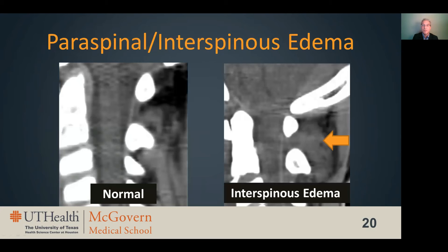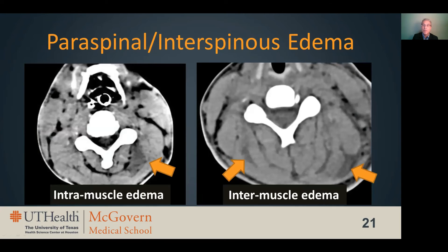The last commonly seen soft tissue finding on CT is paraspinous or interspinous edema, which can be hard to recognize on CT unless it is florid. I identify interspinous edema by seeing confluent replacement of interspinous fat by soft tissue density. On the left, a normal patient shows fat visible between the spinous processes at each level. On the right, complete obliteration of the interspinous fat by soft tissue at C1-2 represents interspinous edema and hemorrhage. Paraspinous edema can present as either focal decreased attenuation and expansion of the muscle or as edema obscuring the intermuscular fat planes.